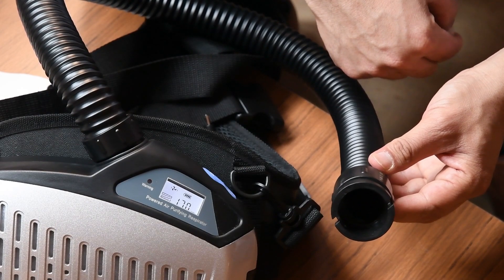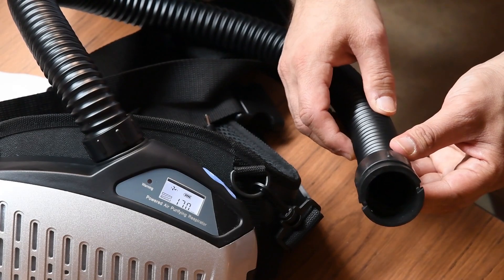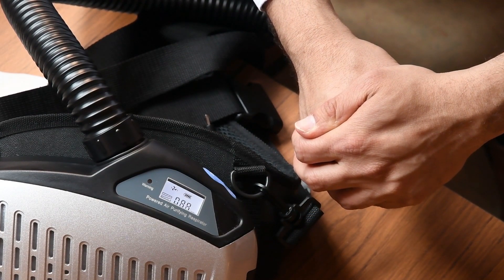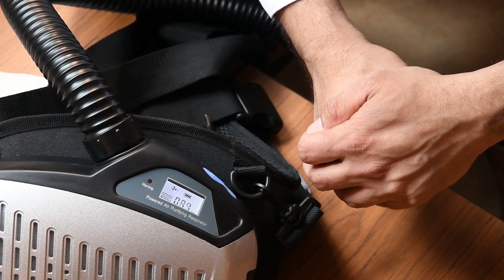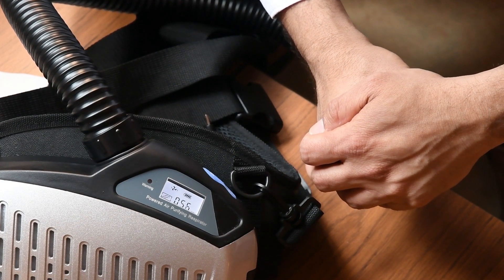Airflow alarm test. When the unit is running, you cover the tube tightly with your hand, and you can see the pump is working very hard to maintain the flow. Keep pressing it until you hear an alarm.